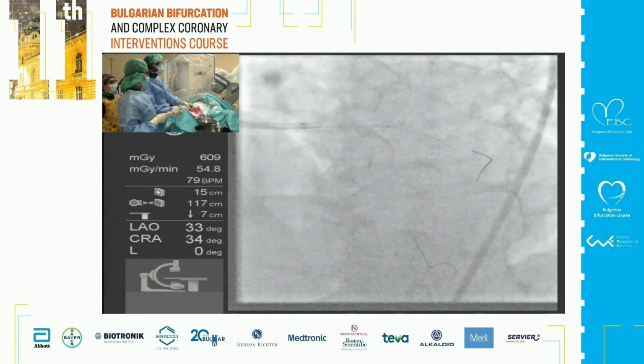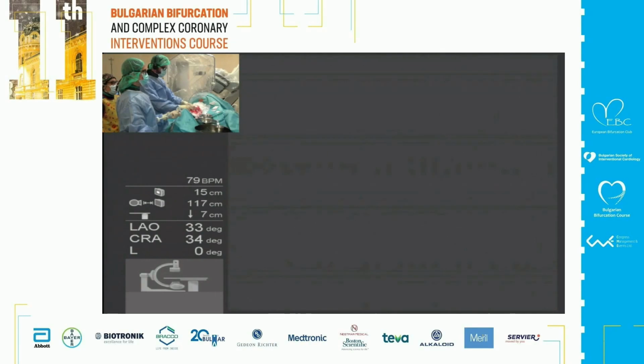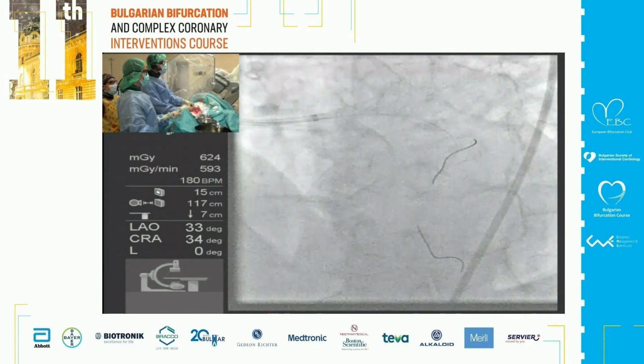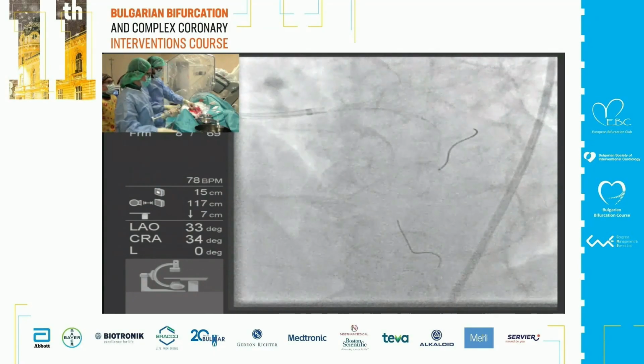So can we have a result in the previous projection? Just an idea, because this is a course. Normally I'm not doing injection at that time. You see, it's not so small, huh?